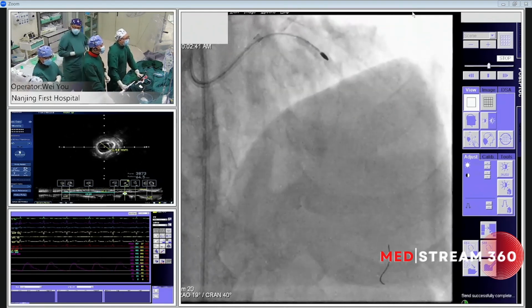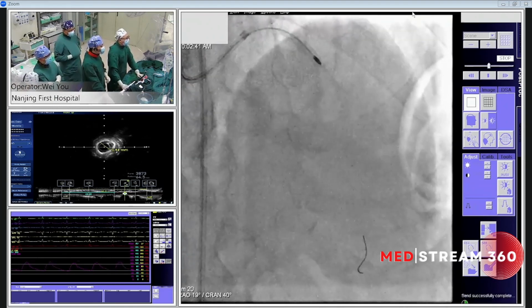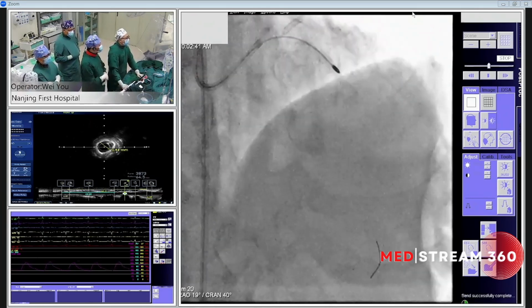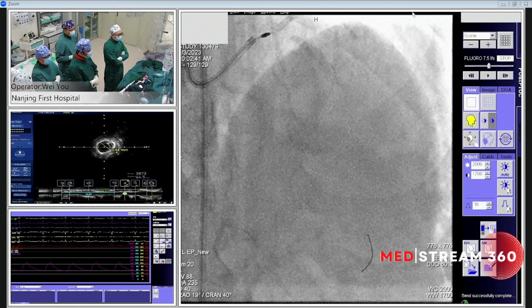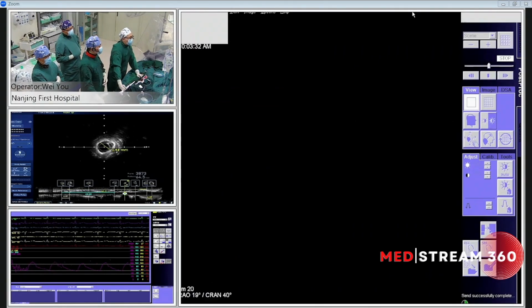160,000. There is some resistance. 5 seconds. Okay. Thank you. Here is our target, very severe and circumferential superficial calcified lesions. 15 seconds. Okay. Still some resistance. Maybe we still need the third round. Yes, third round. Okay, the third round is ready.